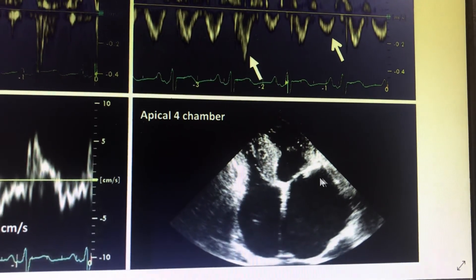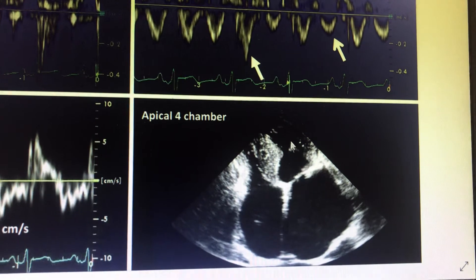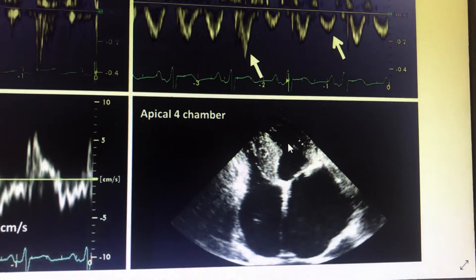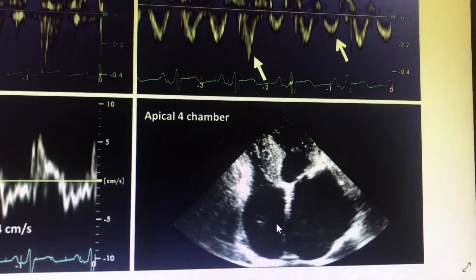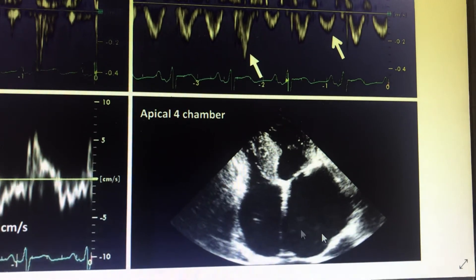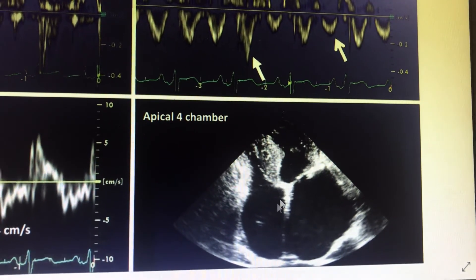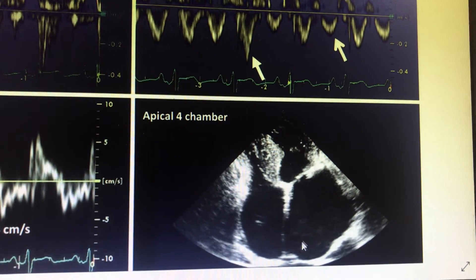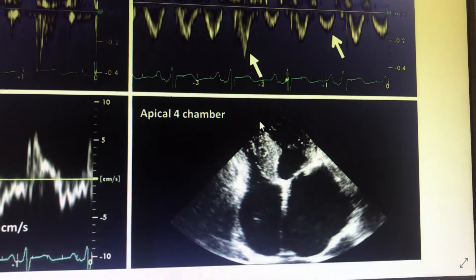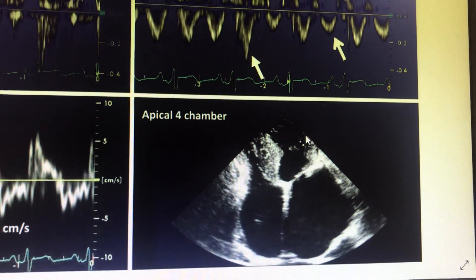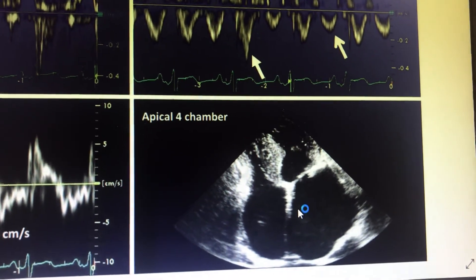Two-dimensionally, you will find diastolic dysfunction with a mildly enlarged LA and RA, as the atria are reflecting the elevated ventricular pressures. Other findings include thickened valves, thickened IAS, and possible LVH — all of which can be seen in this condition.